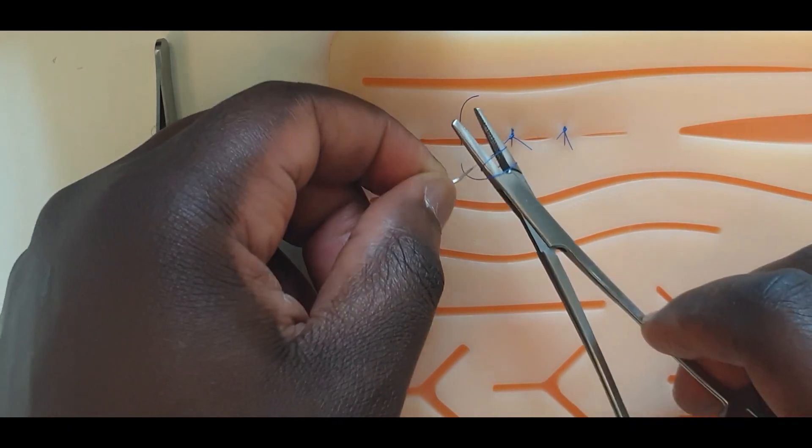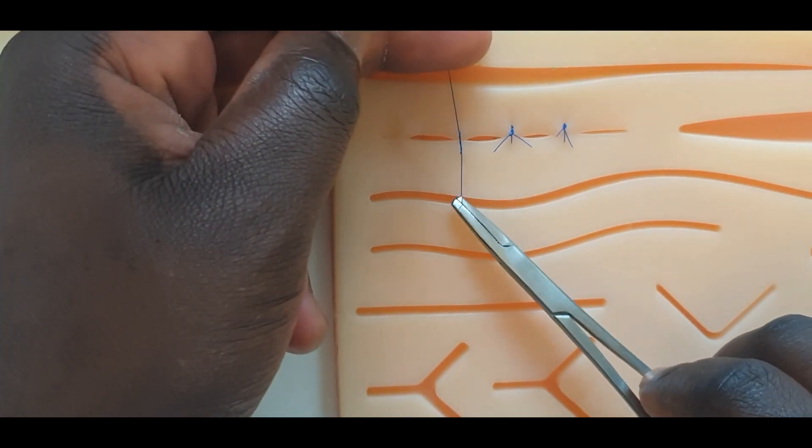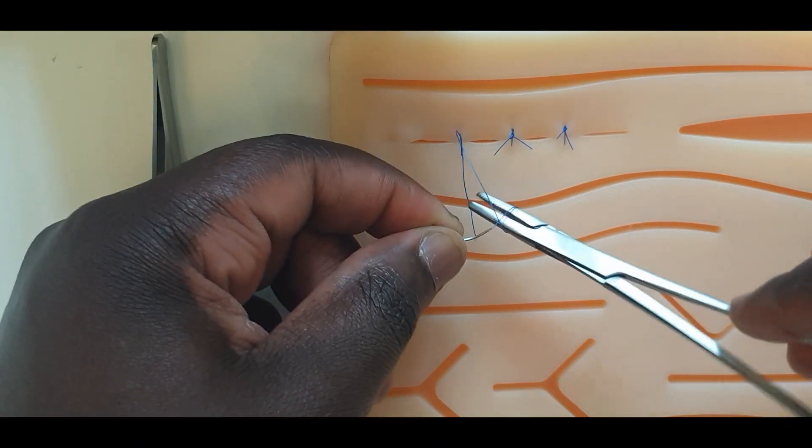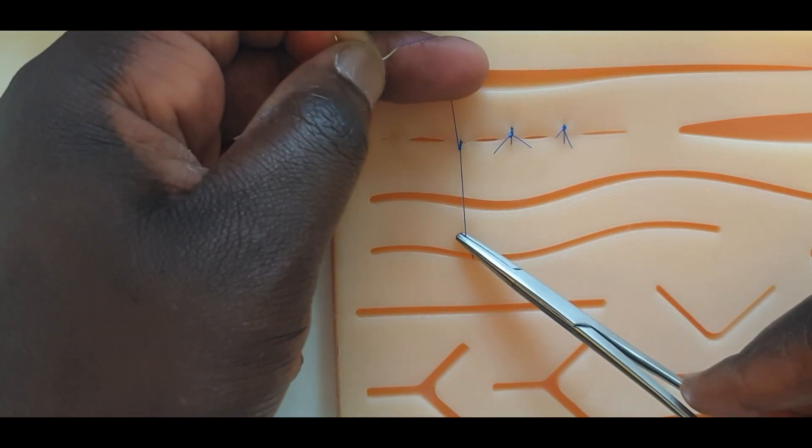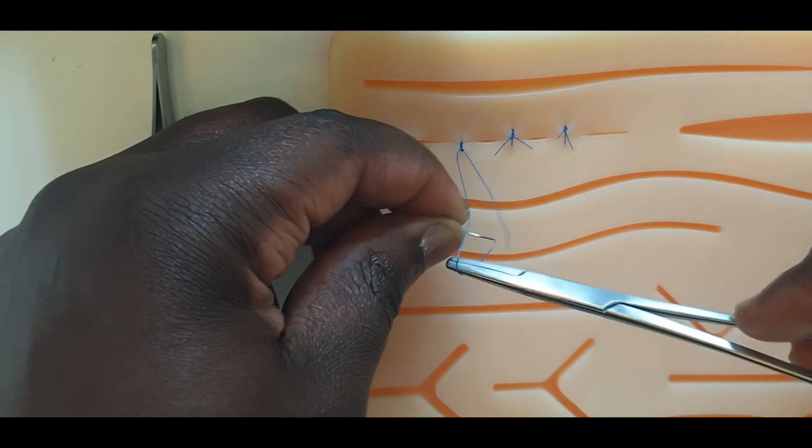A surgeon's knot is made. A reef knot is to follow, however, when tightening this knot, you do not alternate the direction of the threads.